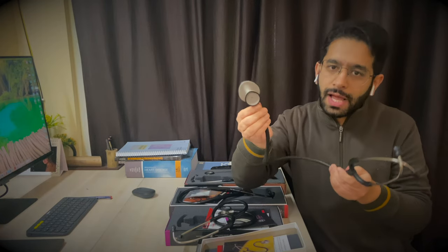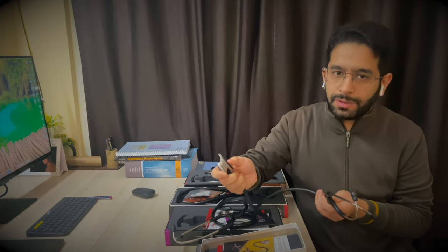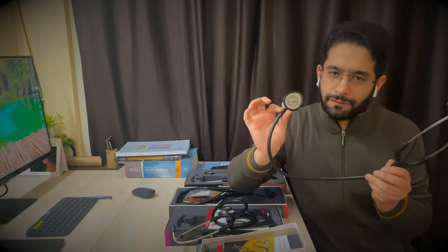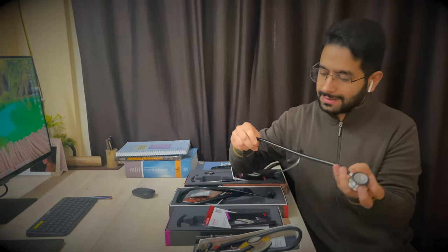The lightweight stethoscope has a bell on one side and a tunable diaphragm on the other, so you can listen to different frequencies of sound and do a basic physical examination.